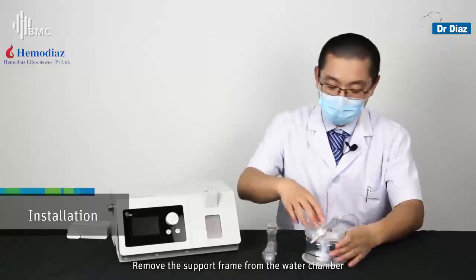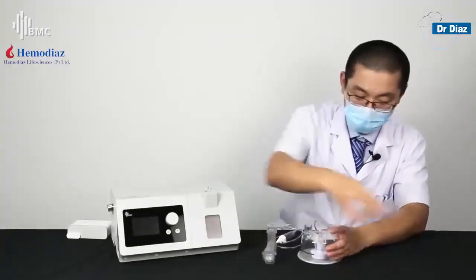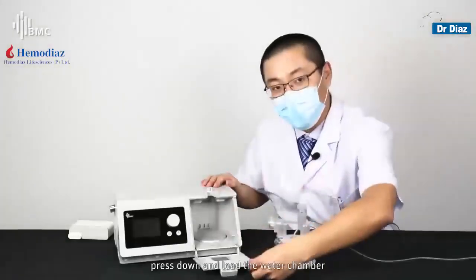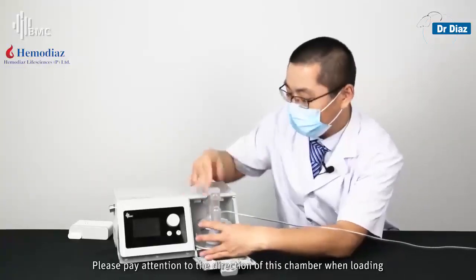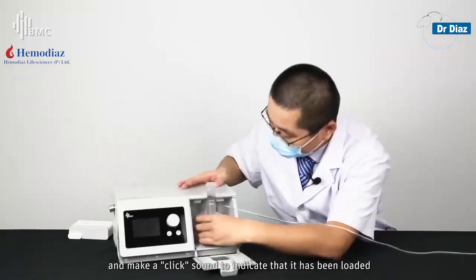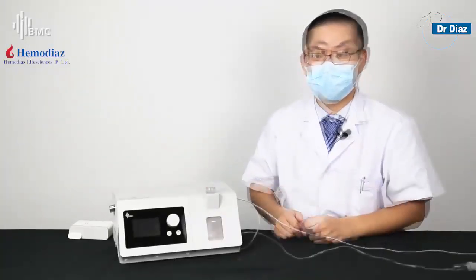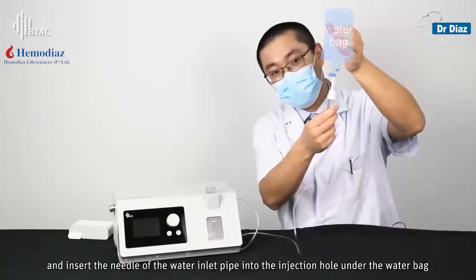Remove the support frame from the water chamber. Connect the exchange connector. Open the water chamber cover. Press down and load the water chamber — pay attention to the direction when loading and listen for a click sound to indicate it has been loaded correctly. Fix the water inlet pipe, close the cover of the water chamber, and insert the needle of the water inlet pipe into the injection hole under the water bag.